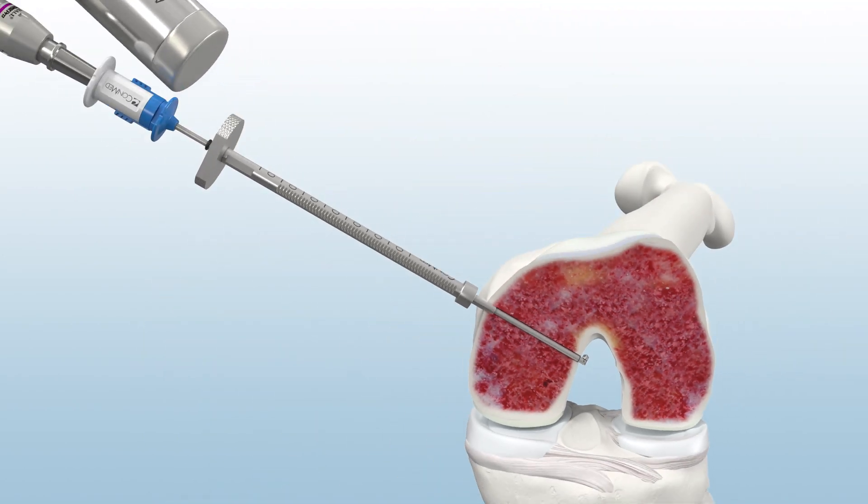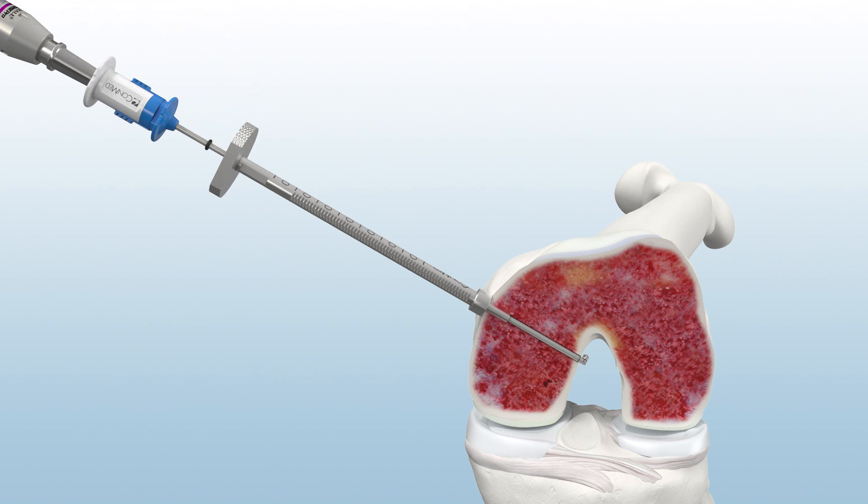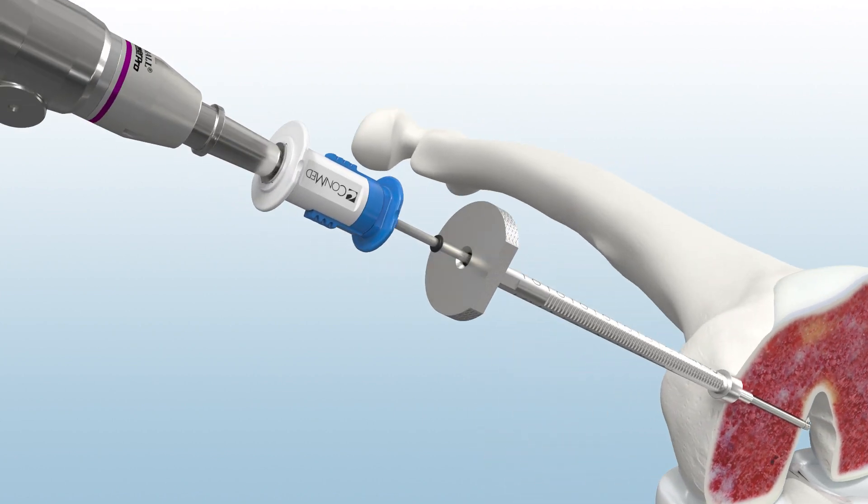Next, mallet the sleeve tip into bone until the positive stop is engaged. To observe graft tunnel length, advance the black O-ring until flush with the base of the sleeve.